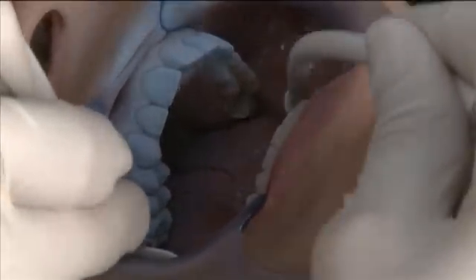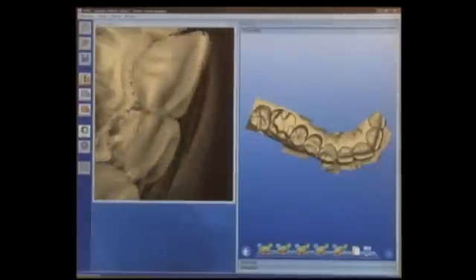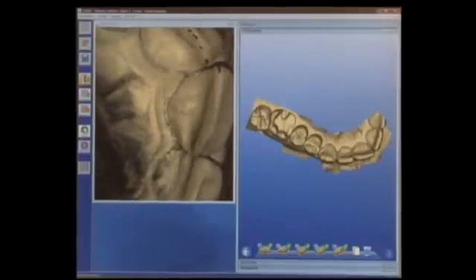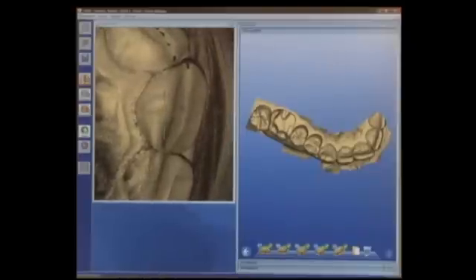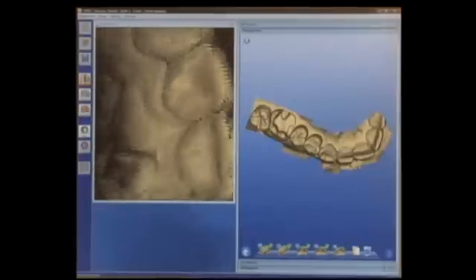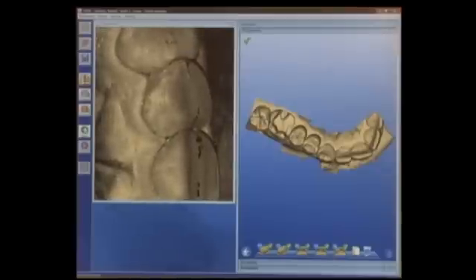Now we'll activate the camera in live capture mode. This time we're going to start from the mesial and go to the distal. So I'm actually going to start on the lateral to central incisor area of the opposite side of the arch, or the side that I just captured. Then we'll work our way mesial to distal, crossing across the midline and working into the quadrant that we're capturing in this imaging session.